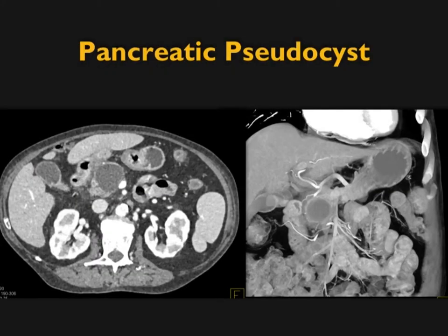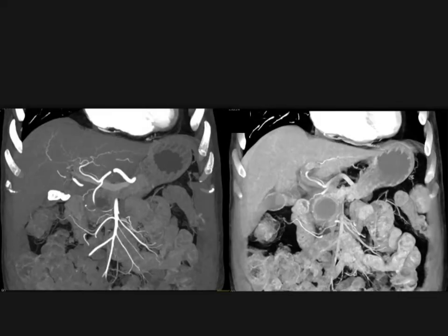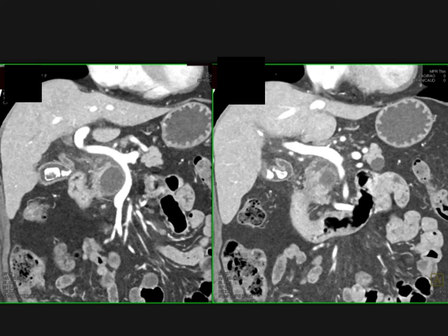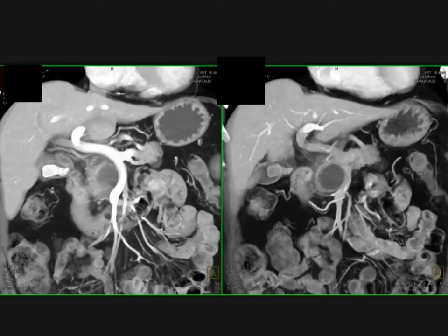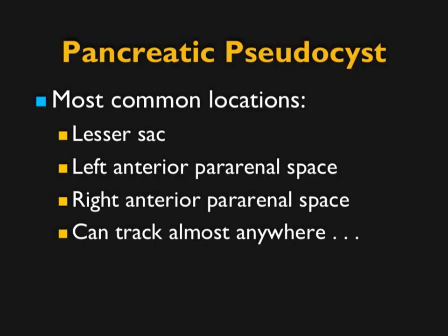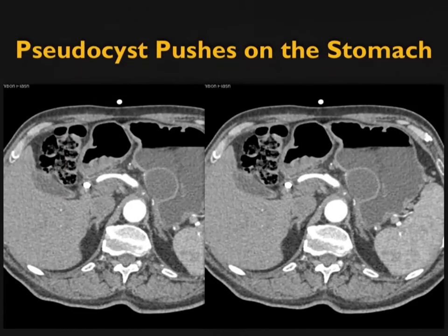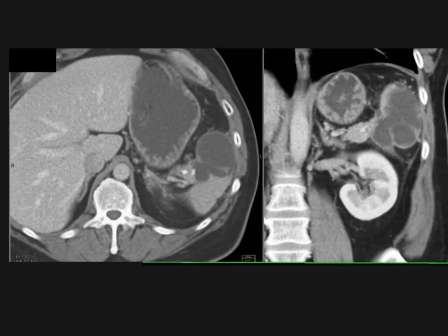These are well defined. Could this be something else? With a history of pancreatitis, this was a pseudocyst — you can see it can displace the vessels, pushing against the GDA and portal vein and SMV, but not invading them. Pseudocysts can be large or small, solitary or multiple. Think location: lesser sac, left anterior pararenal space, and right anterior pararenal space are most common, but they can track almost anywhere — posterior pararenal spaces, along the psoas or iliopsoas, into the spleen. They can result in spontaneous splenic bleed or spontaneous rupture.